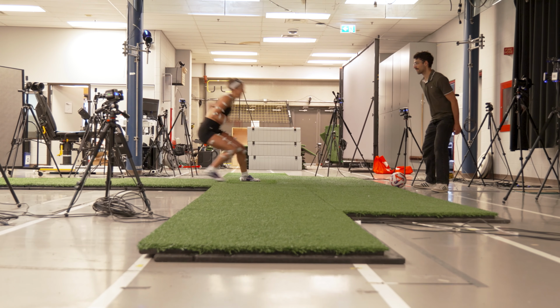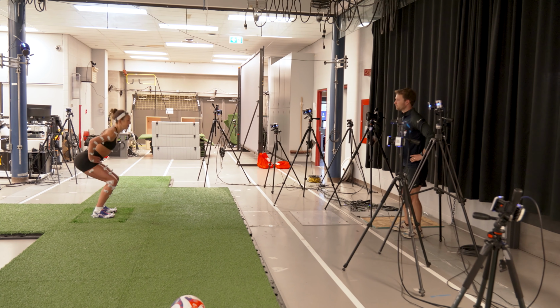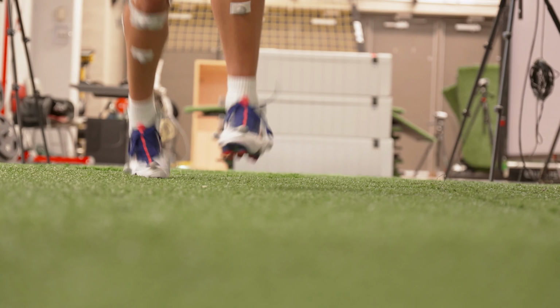We start down at the foot and then work our way up as a part of our analysis. So we want them to land a bit more on that forefoot to reduce stress on the knee. So we might say land more on the front part of your foot, but also try to land softly and quietly so we can't hear you.